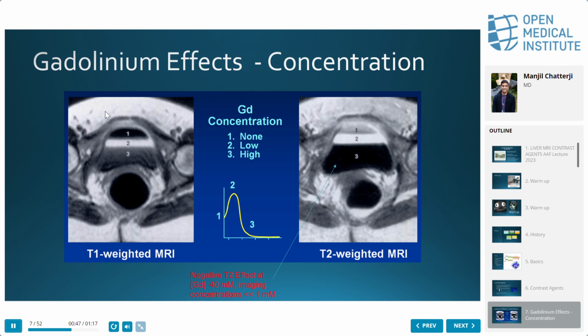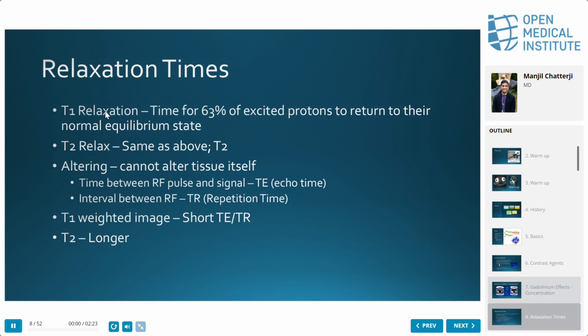But just in your minds, keep up with me here, that the optimal concentration will result in bright signal. And then when there's too much gadolinium, similar to Suzanne just explaining to us about the lipohemarthrosis, at the bottom of the bladder where the most dense gadolinium sort of layers, you will find dark signal again, because at the highest concentrations, again, there's no more signal there. Does this kind of make sense to everyone? Because it's going to build on this in the next one. T2 is the opposite, but let's not worry about that for now.